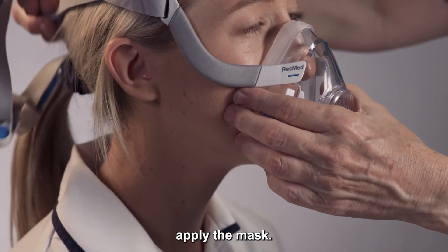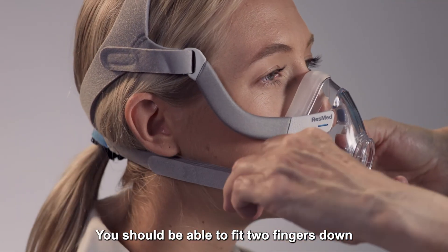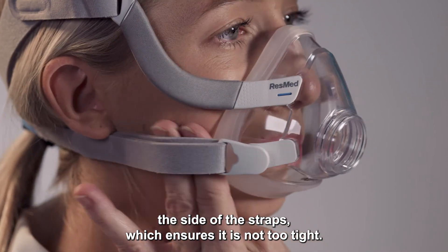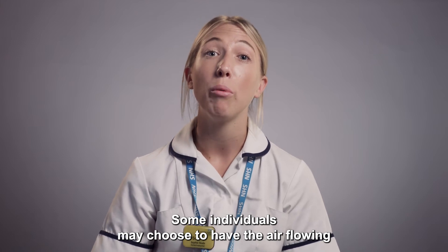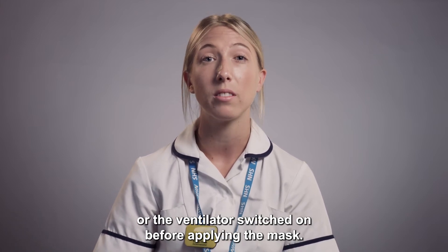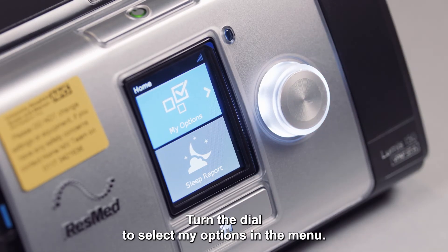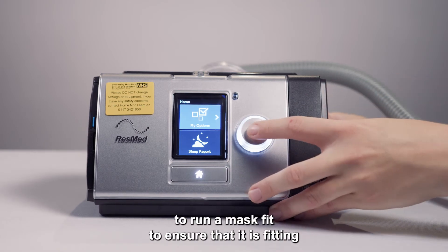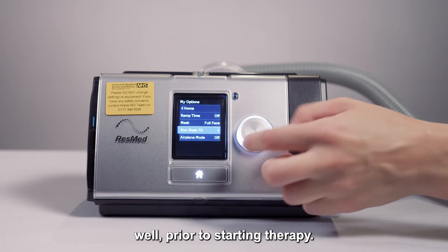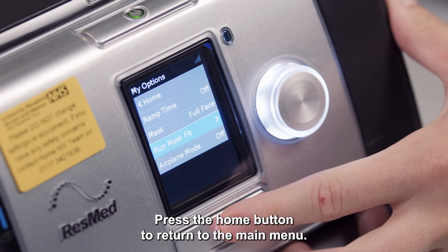Firmly but comfortably apply the mask. This should sit on the bridge of the nose and in the chin groove. You should be able to fit two fingers down the side of the straps, which ensures it's not too tight. Some individuals may choose to have the air flowing or the ventilator switched on before applying the mask. Press the power button on the top of the ventilator once to turn it on. Turn the dial to select your options in the menu. You have the option to run a mask fit to ensure that it is fitting well prior to starting therapy; however, you do not need to complete this every time.